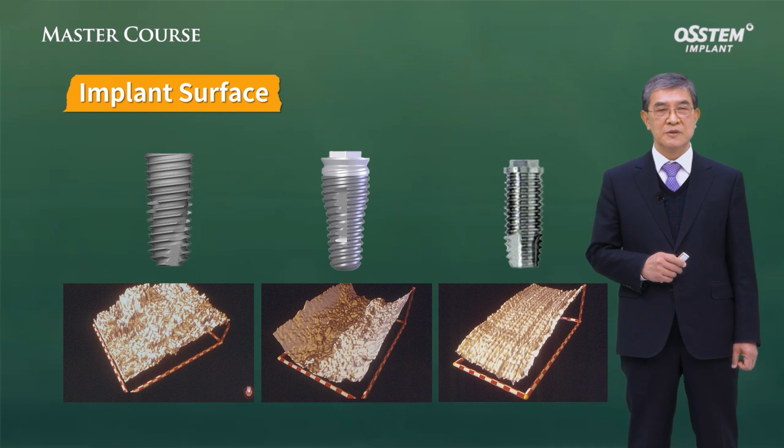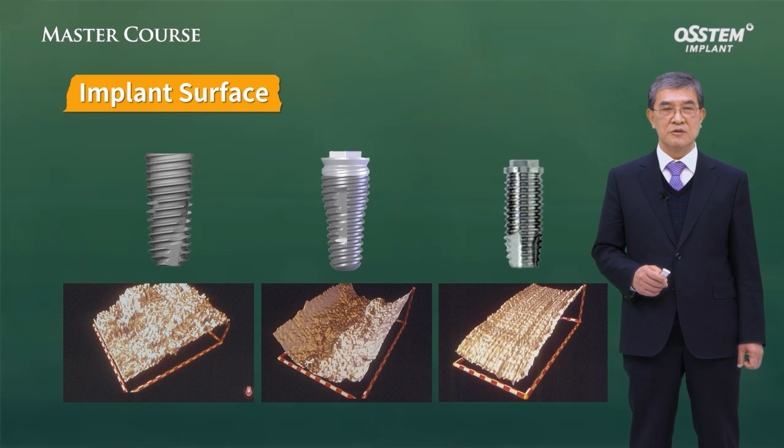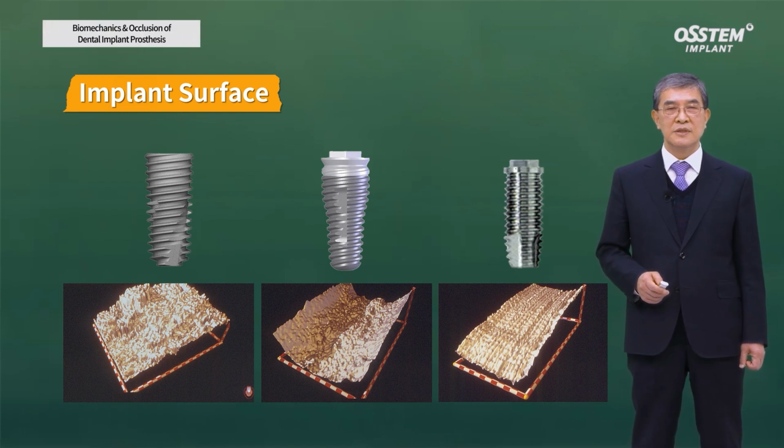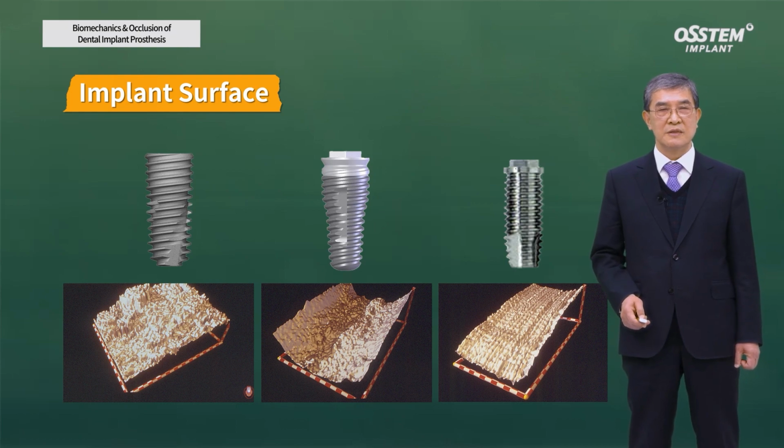Appropriate rough surface is right. It shouldn't be too rough or too smooth. When we talk of roughness, we talk about Ra and Sa. The surface should have about an Ra/Sa of 1.5 to 2.0.